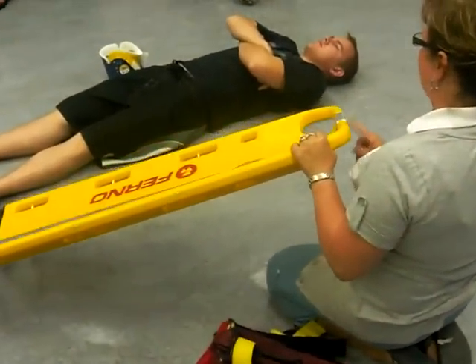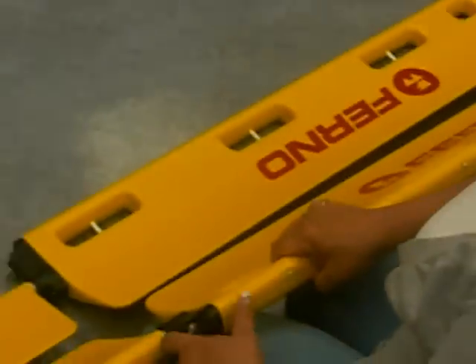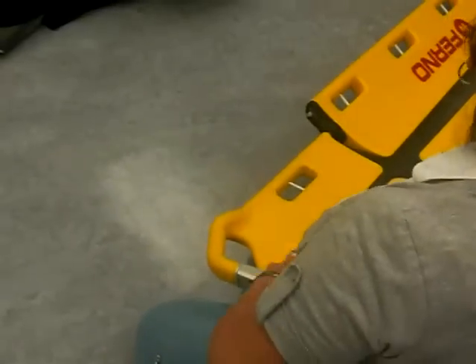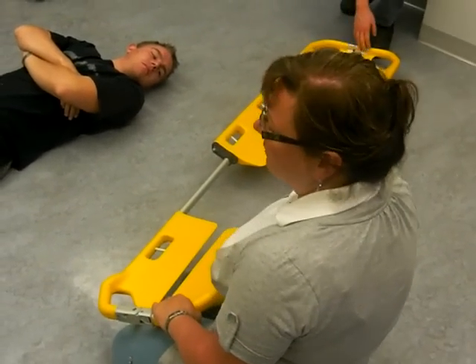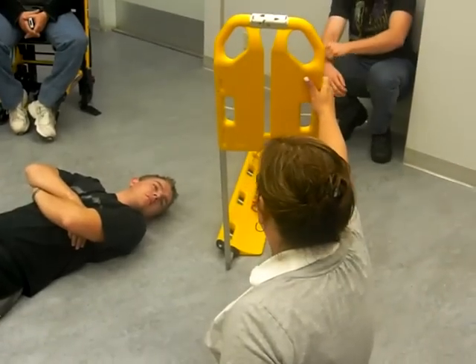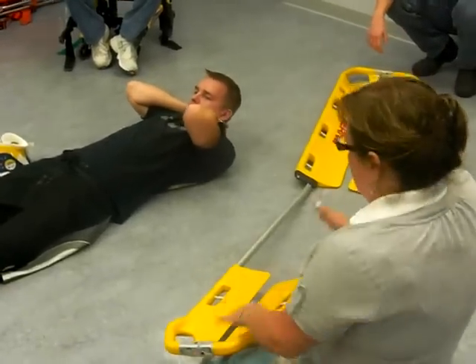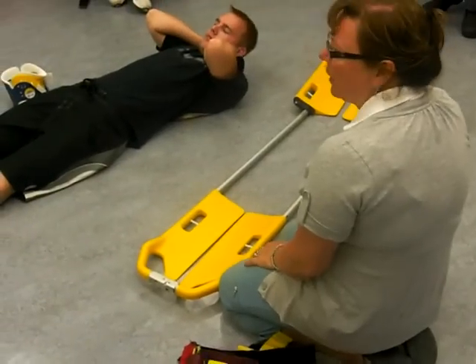There are two things at the top and bottom that you need to push for it to release. There's the same thing at the bottom to release, and then it splits in two. This here is so that you can extend your scoop. You can extend it to a variety of different sizes depending on how tall your patient is. If you extend it all the way, it will pull in half. So it's shorter when you put it away — fold it in half, especially in an ambulance. It's got a little cord or opening you can slide it in and store it.